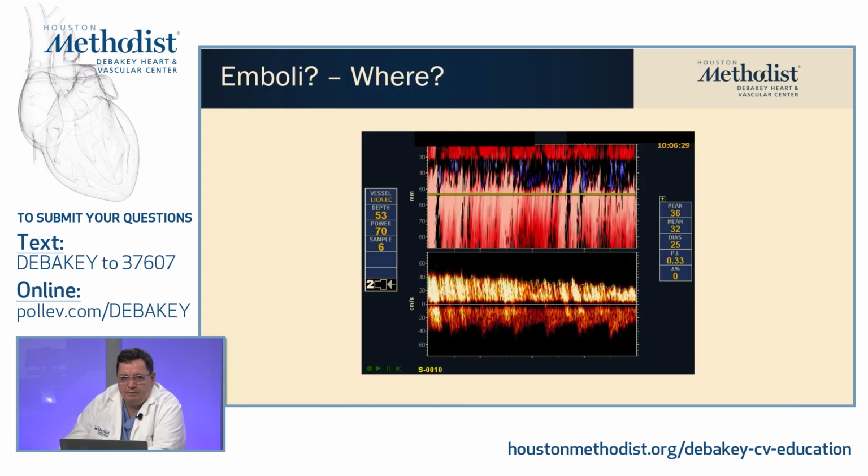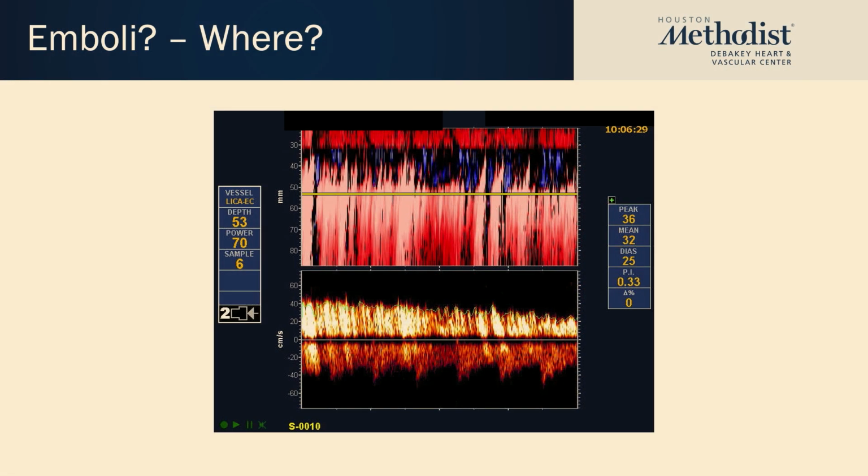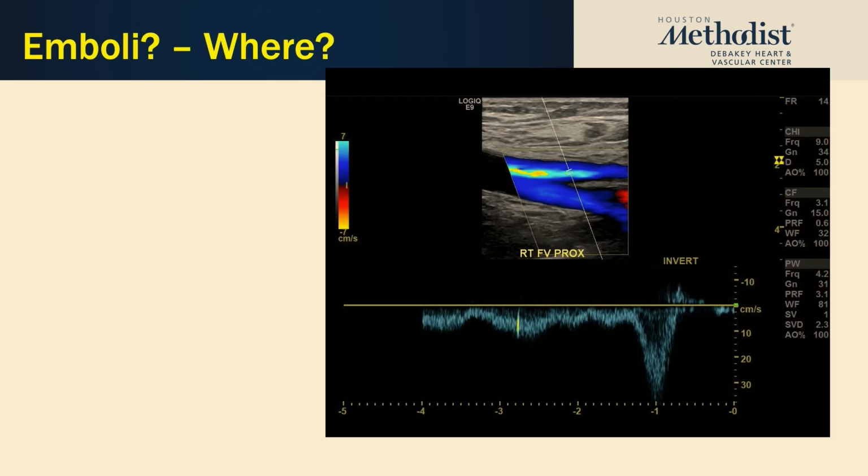Also pay attention that if you are on the bad side and the nurse is injecting something into the IV, you're able to pick up some venous embolization. You see a non-pulsatile flow pattern, and in that non-pulsatile flow pattern you probably wouldn't see any flow, but that is not arterial. Those are all probably coming from the IJ. And thanks to COVID, we started to pay attention to this tiny microembolic signal on the venous studies. So again, in this case, we did not see any major clot.